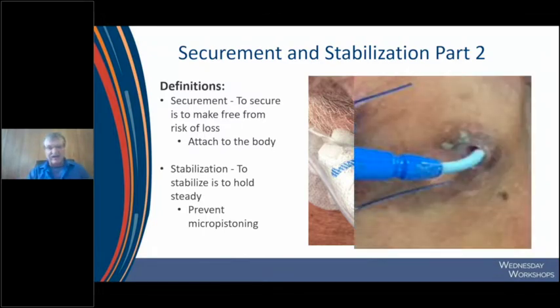Stabilization, you can see this catheter. Here is where the sutures are. You can see it. It's really blown up. This little channel right here was for a suture, and guess where it was attached? Right here where these two pus pockets are. This is not good at all.